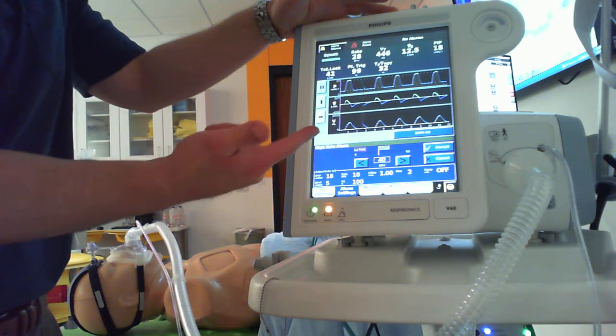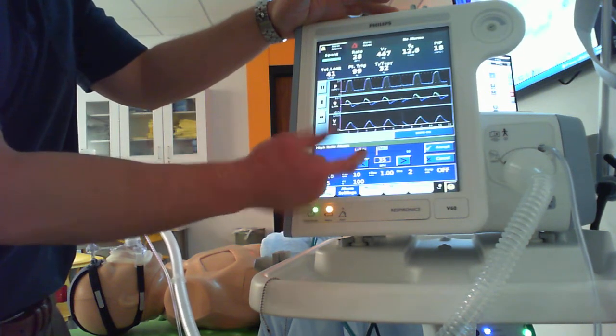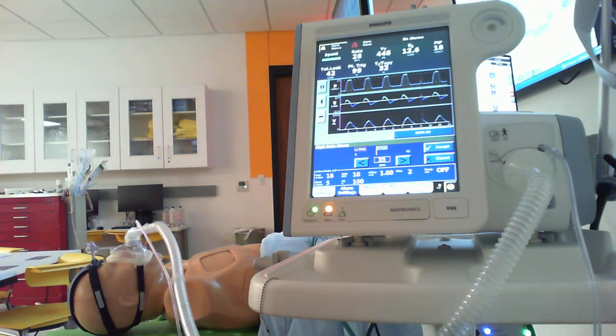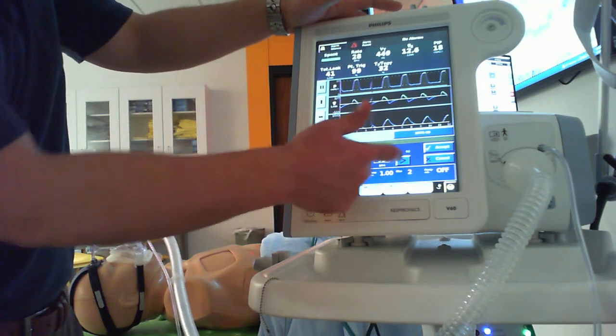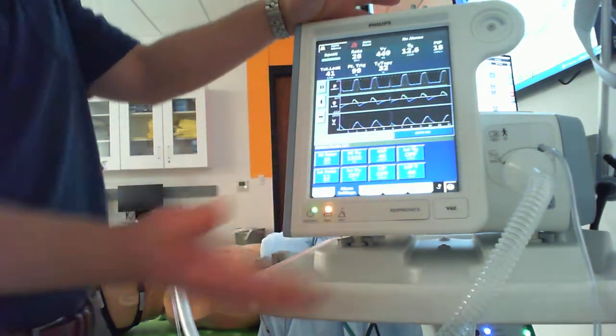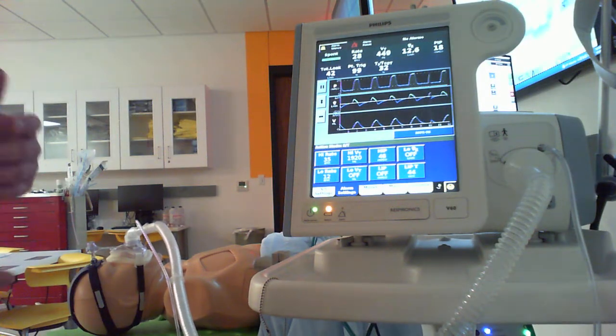When I started, I was trying to get them down below 30, and I'm there. I don't want this thing to honk every single time, so generically, for most patients, I'd set this at 30 to 35 a minute. 30 is pretty tight, so you could set it anywhere in between. You could set it at 35, and if they hit 35 and sustain, so something's happening, their condition's worsening, it would alarm and let you know that, okay?